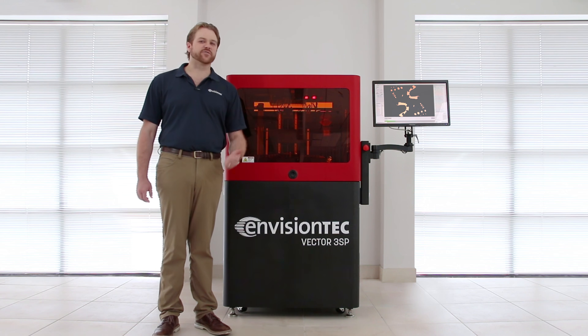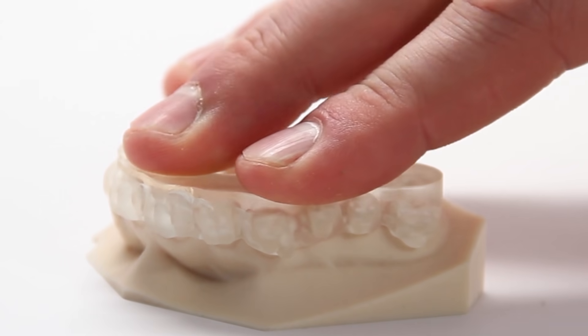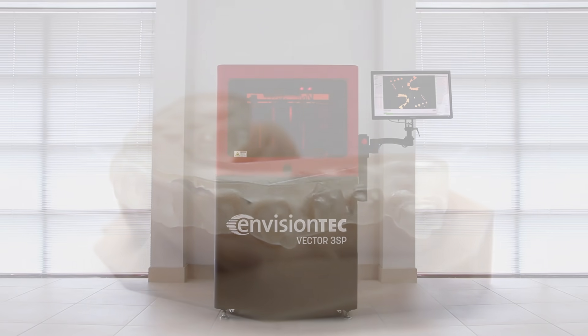3SP stands for Scan, Spin, and Selectively Photo Cure. This yields some of the most accurate 3D printed models currently available for the digital dental and orthodontic laboratory.